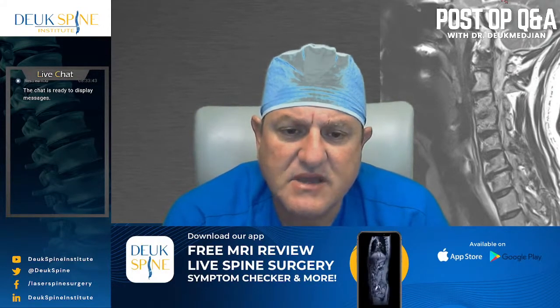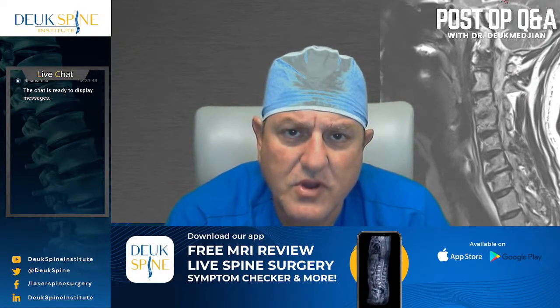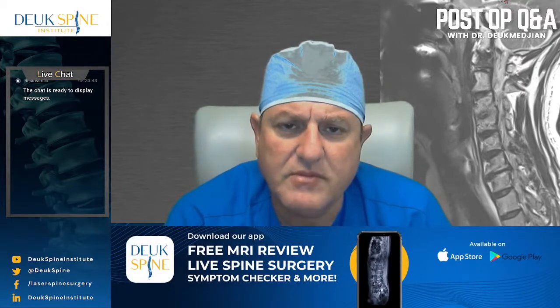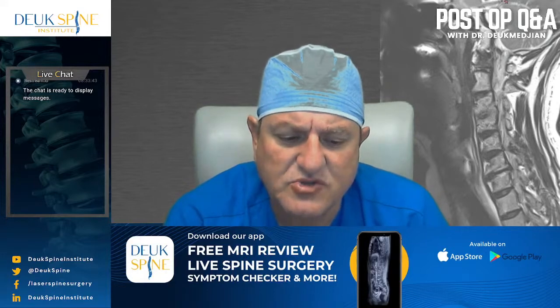Again, this is an endoscopic cervical spine surgery for a herniated disc at C6-7 in a patient whose left arm is going dead, basically, and he has no strength in the arm.